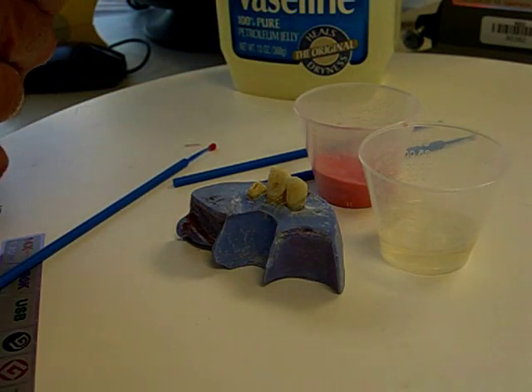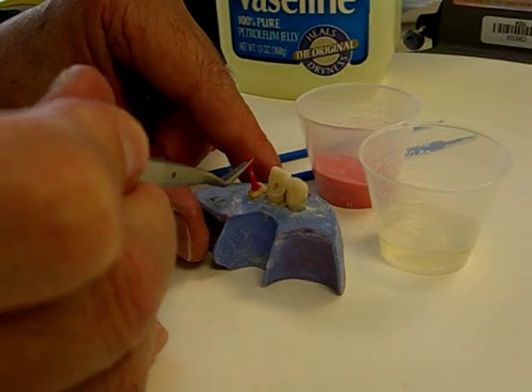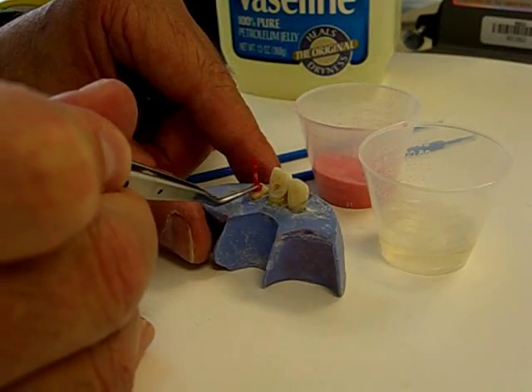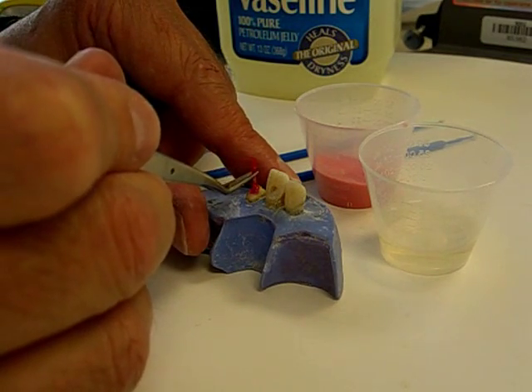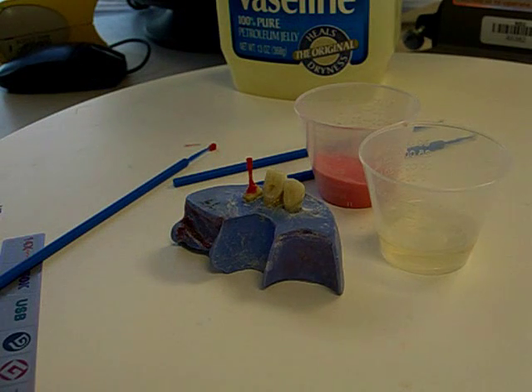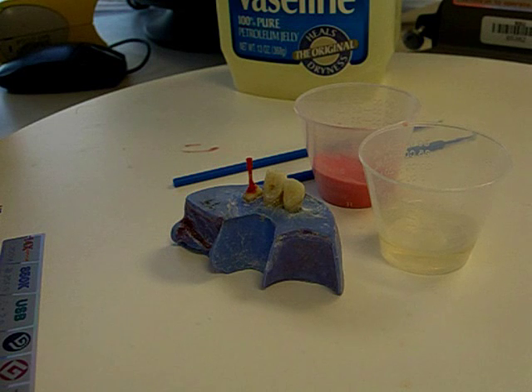Let's reinsert that into the canal space and see if we can capture the internal anatomy as accurately as we can. Remember, ladies and gentlemen, if there are any undercuts, you will bypass those undercuts if you alternately remove and replace the post before the acrylic polymerizes fully.